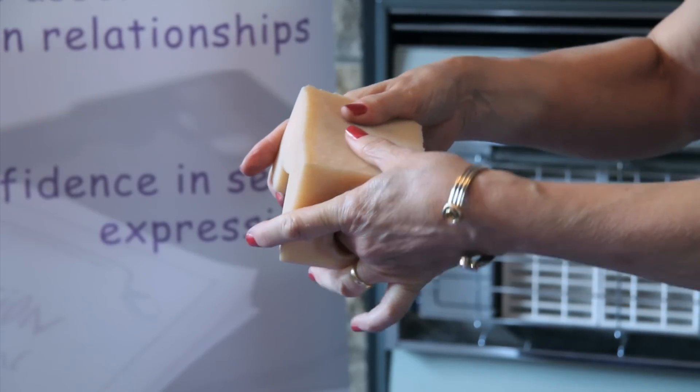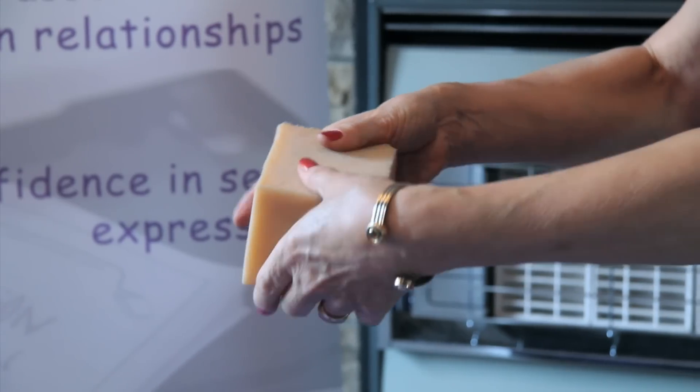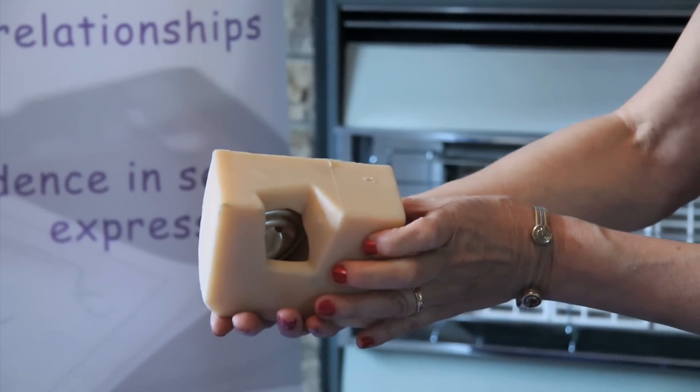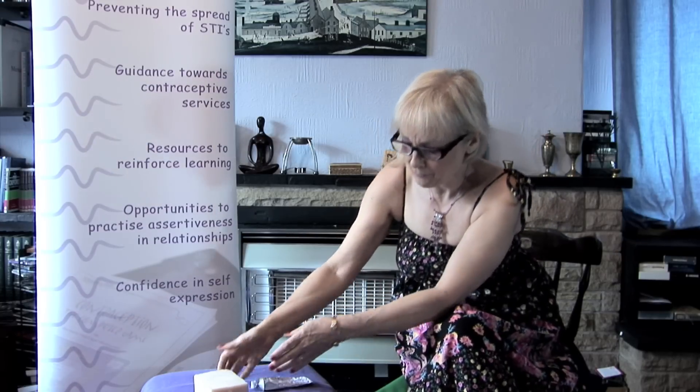When she feels for the neck of the womb, she can feel that it's covering it. One part of the diaphragm is behind, the other part is in front, and then if I turn this round, you can see that it's in place. Now that diaphragm stays in place after intercourse, and after about six hours it can be taken out, washed and reused. That space of time allows the spermicide the time to do its work of killing sperm.